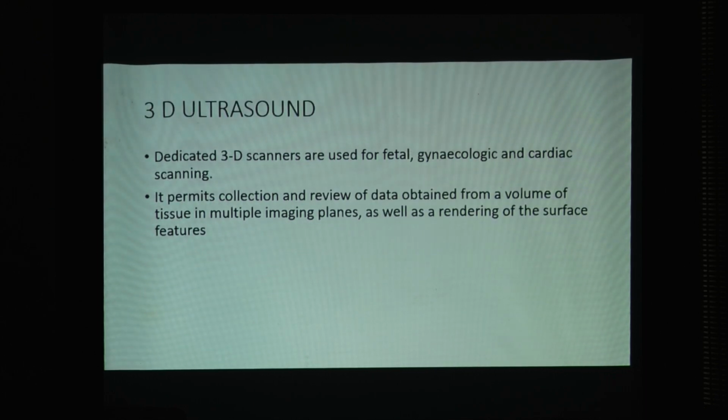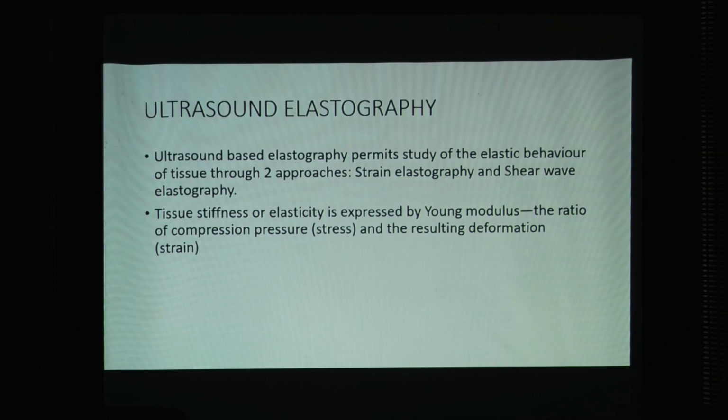Now 3D ultrasounds are there for obstetric imaging. You can see the fetus. For cardiac imaging also it is used. And now there is 4D imaging also, that is live. This is the 3D imaging. And now ultrasound can be used for very many uses. One that is currently popular is elastography.